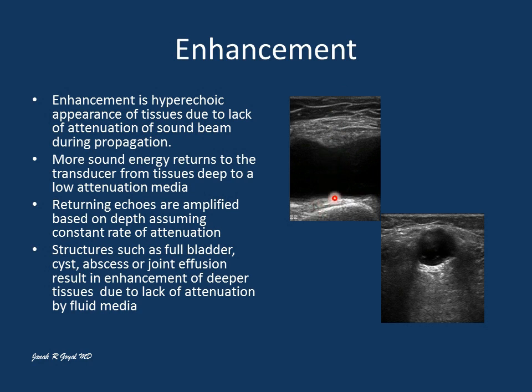So it applies an amplification and the structure becomes very bright. Structures such as a full bladder, cyst, abscess, or a joint effusion result in enhancement of the deeper tissues due to the lack of attenuation by the fluid media.